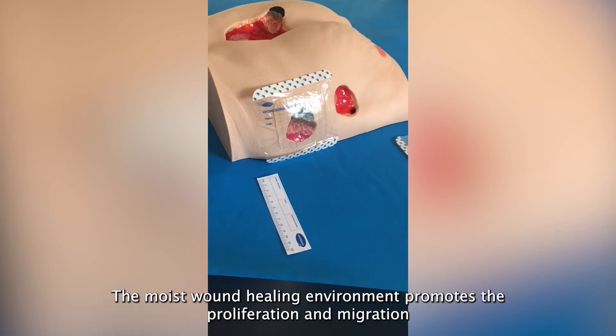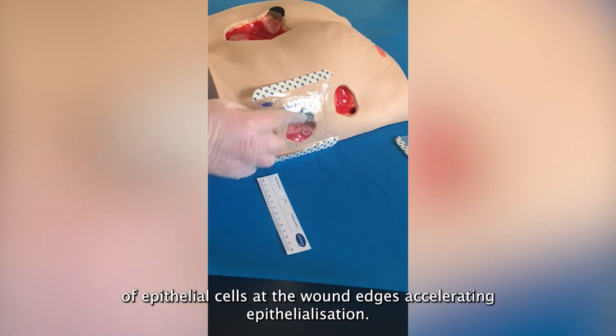The moist wound healing environment promotes the proliferation and migration of epithelial cells at the wound edges, resulting in accelerated epithelialisation.